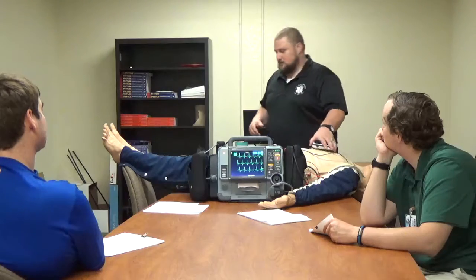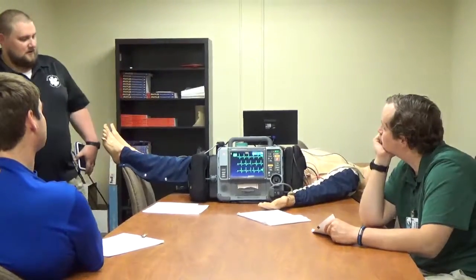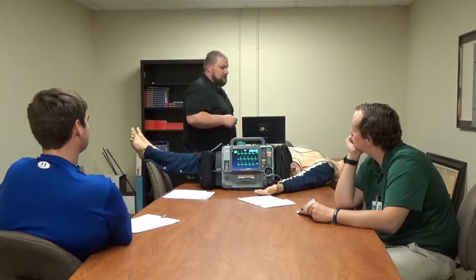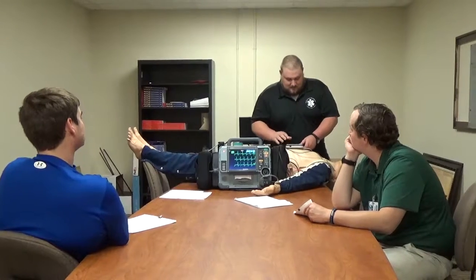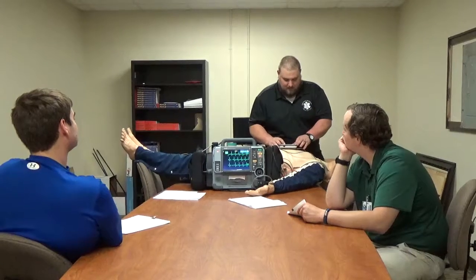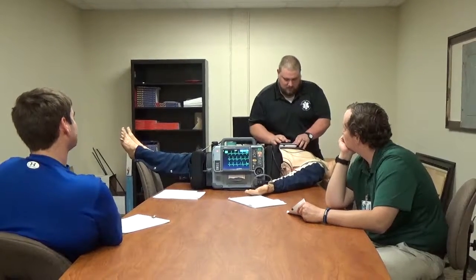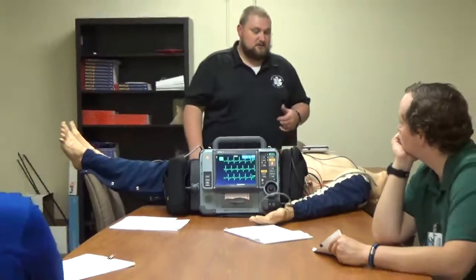Now, most of the time when we start having problems with AV blocks, it's going to take place right around the AV node or just below the AV node. And when we start having AV blocks below the AV node, that's when we get into what we call high degree heart blocks, second degree type 2 and third degree heart blocks. First one we're going to talk about today is a first degree heart block. And the number one way to distinguish a heart block, no matter what it is, whether it be first degree heart block, second degree type 1, second degree type 2, or third degree complete heart block, is our PR interval.